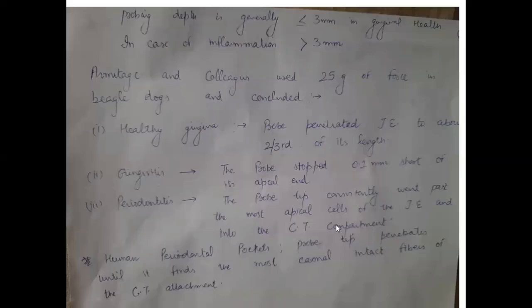But when there is inflammation of the periodontium, when the connective tissue is inflamed, when the connective tissue fibers are being destroyed, then the tissue cannot offer more resistance. So the probe tip goes consistently past the most apical cells of the junctional epithelium, and it goes into the connective tissue compartment. In human periodontal pockets, the probe tip penetrates until it finds the most coronal intact fibers of the connective tissue attachment.